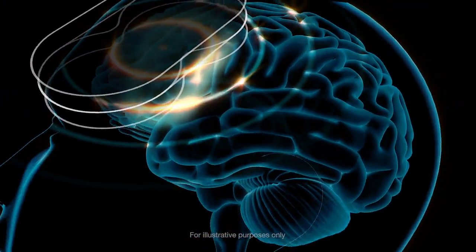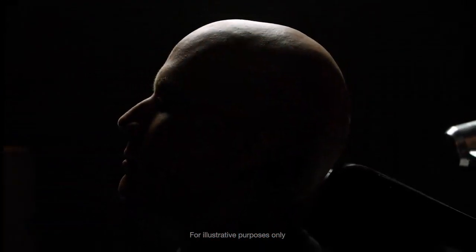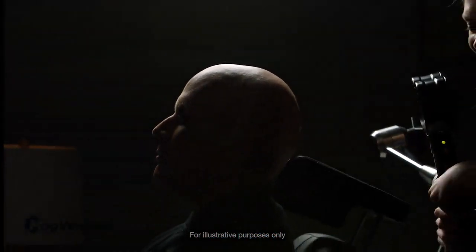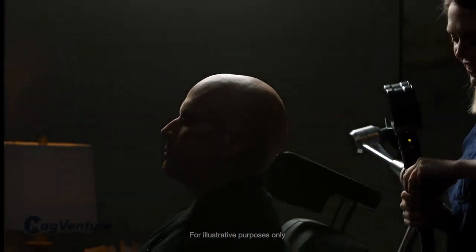Like training a muscle, over time, the inactive signals begin firing and reconnecting properly again, and thus restoring the emotional control center.